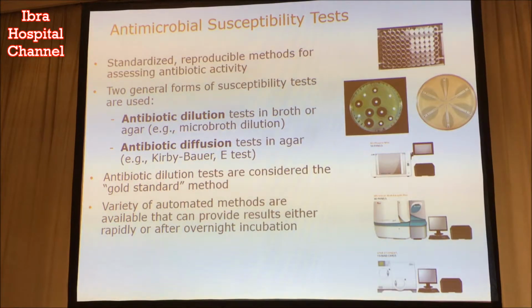I'm going to step back just a little bit and sort of set the foundation for the work that I'll talk about afterwards. I'm going to start with a discussion of antimicrobial susceptibility testing. And for those in the lab, all this is going to be fairly rudimentary, but for everybody to be sort of at the same level as I walk through this, we'll start with antimicrobial susceptibility tests, and there's really 2 general forms that are used.